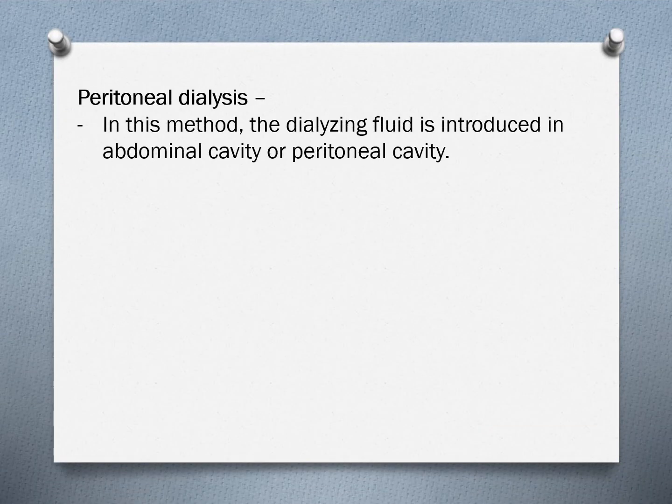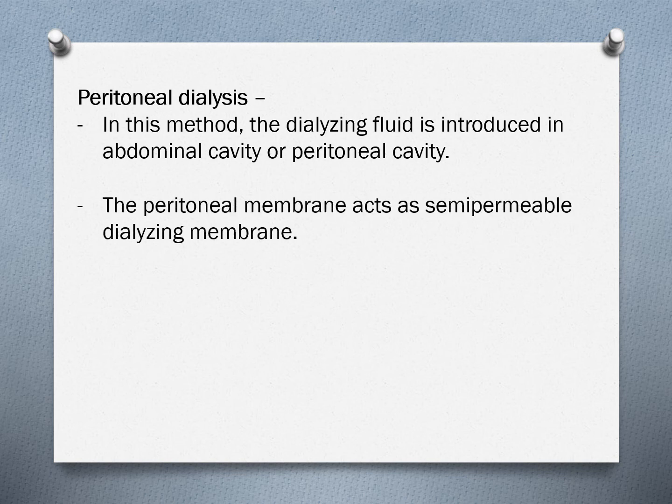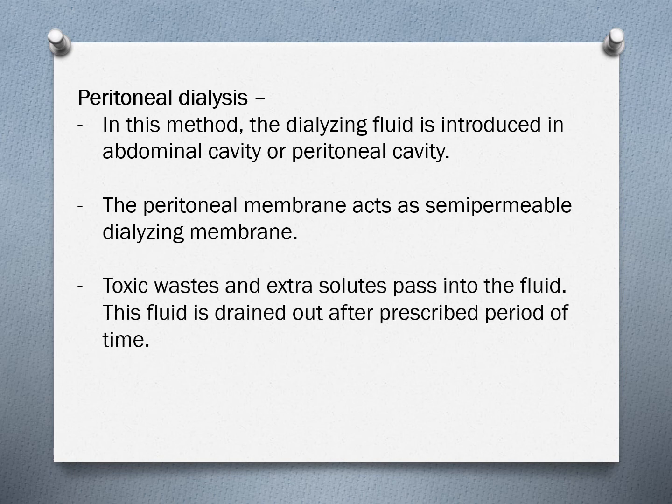Peritoneal dialysis. In this method, the dialysing fluid is introduced into the abdominal cavity or peritoneal cavity. The peritoneal membrane acts as a semi-permeable dialysing membrane. Toxic wastes and extra solutes pass into the fluid. This fluid is drained out after a prescribed period of time.